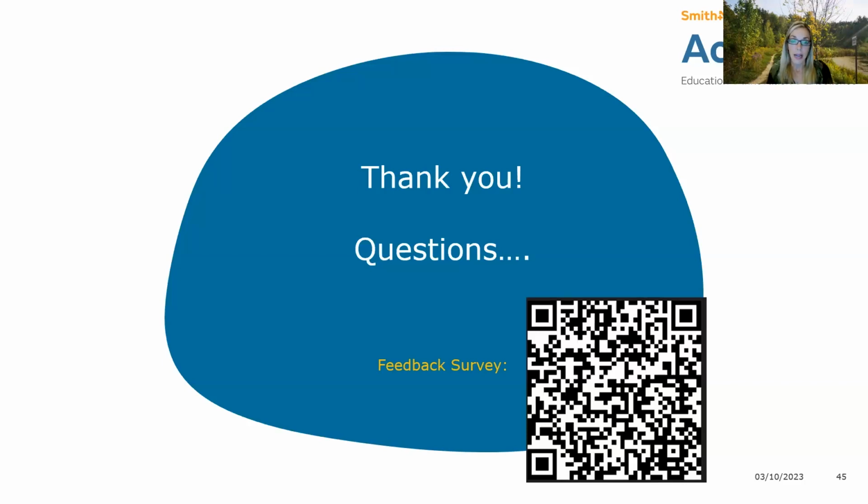It actually did bring down, I didn't actually have the follow-up with this gentleman, unfortunately. It did bring down the edges, because it's been around for a very long time, and as you saw those rolled wound edges, it did flatten them out in the one section. I would have liked, there was almost like a little outpouching that you saw in there. That did not go away as of yet, so probably that would have needed to be cut, or what will happen is it will eventually heal and then you'll be left with the skin tag there. So I would have requested that to be removed surgically just to have that cut back.